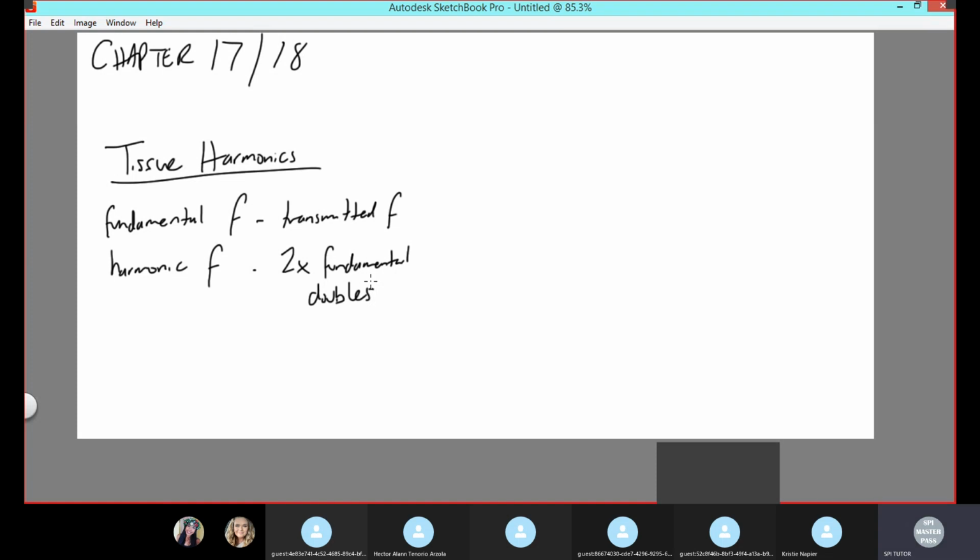So what are the little things that you should know about harmonic frequencies or tissue harmonics? Just little fun facts here and there. It is a nonlinear behavior, so it's not really predictable. That's all they want you to know. You don't have to really go into understanding more about this. Just understand that it is a nonlinear behavior. The way that the wave works is nonlinear.